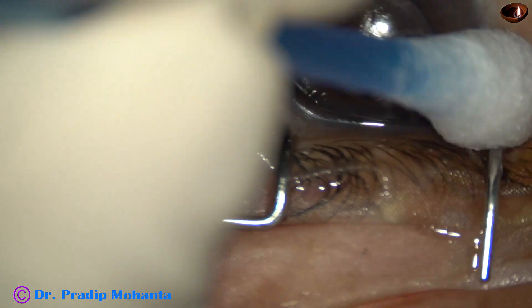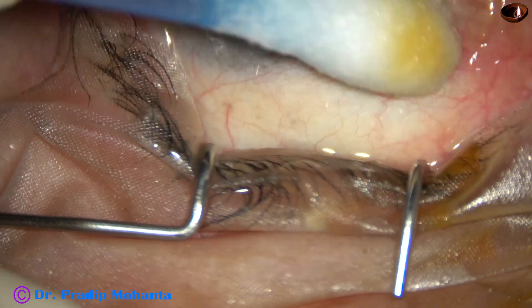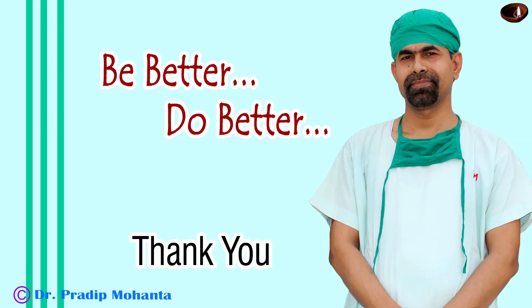So, when the optic nerve is compromised, we can do paracentrasis in this beautiful way. This is a very good technique to do paracentrasis. Thank you very much for your attention. Hope this technique will help you in your practice.